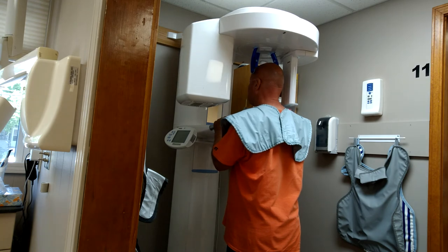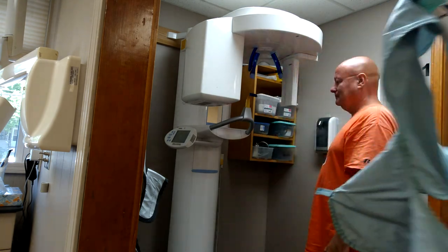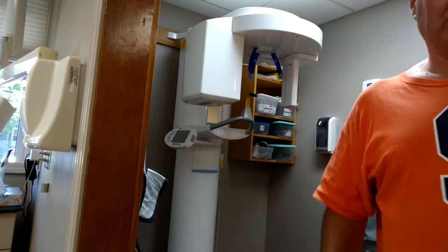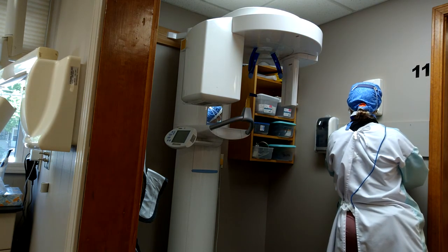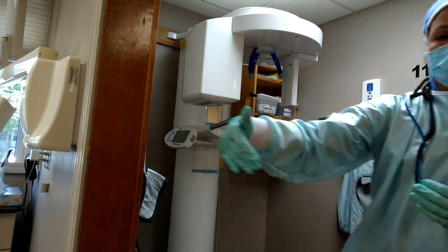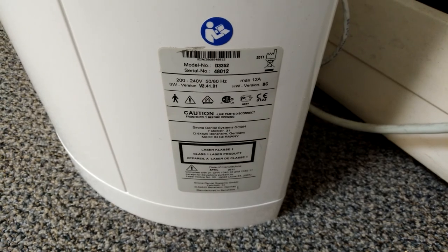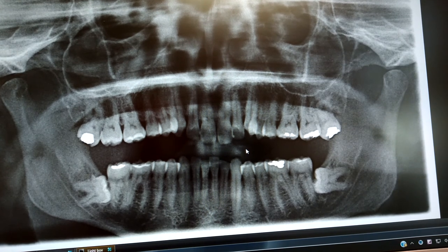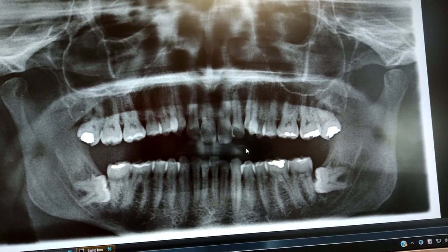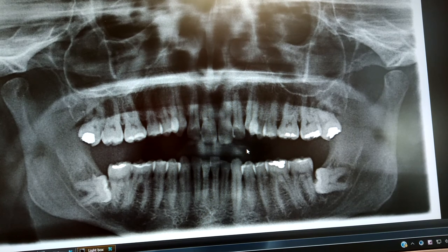All right, very good! All righty, you can back straight up. I'm going to take this lead vest off. So there are two wisdom teeth on the bottom — they're embedded under the gum and the bone. And that's what a panoramic X-ray looks like.